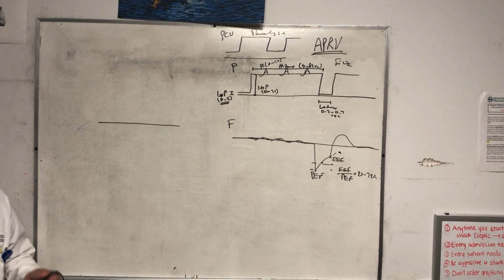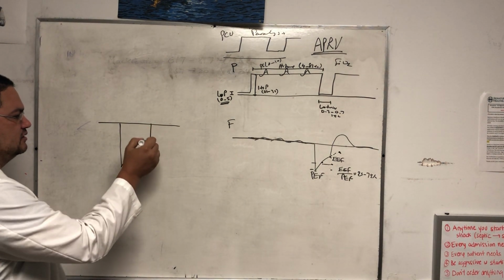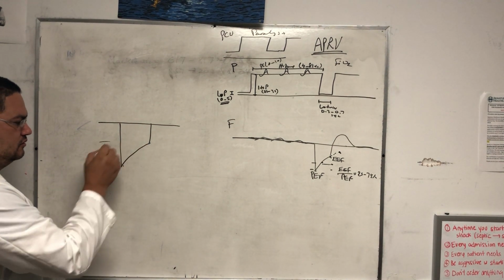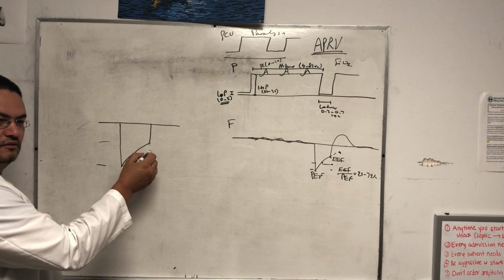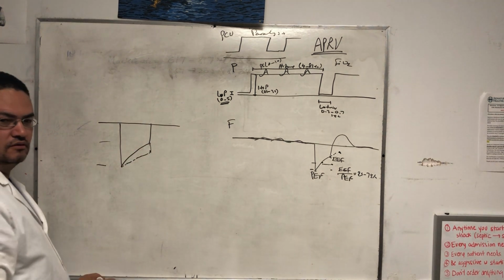Does it mean that the patient is improving or the patient is worsening? If you think about it, it looks like this. This is 50% of that, right? And then you come in at night and it's 60%. So that means this is it here now. That means your curve went like this. So worsening, that's improving.